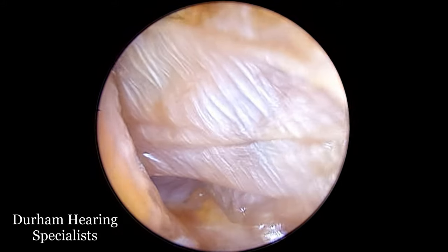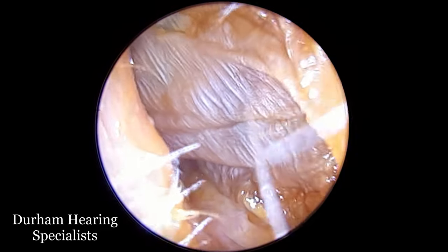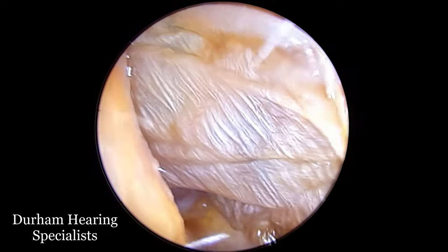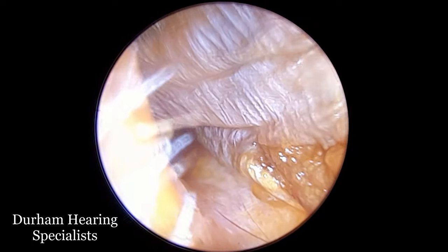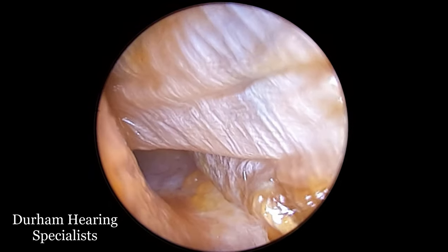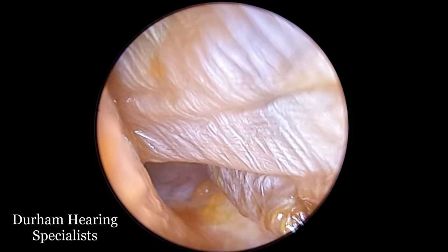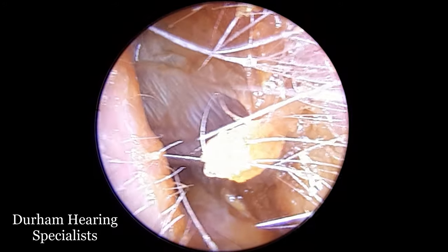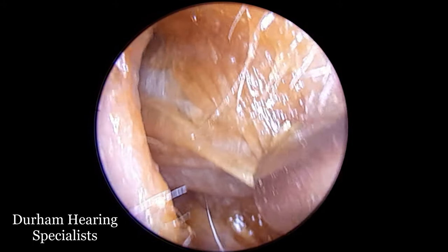You can see here this debris that's sort of wavy, sort of looks a bit like folded pastry. This is an entire sheath of dead skin. It's actually almost essentially a mirror image, or a ghost image, of the ear canal. We see dead skin all the time in the ear canal — it's really nothing special — but this is a rather unusual case. It's quite rare to see such a well-preserved impression of the ear essentially in dead skin form.